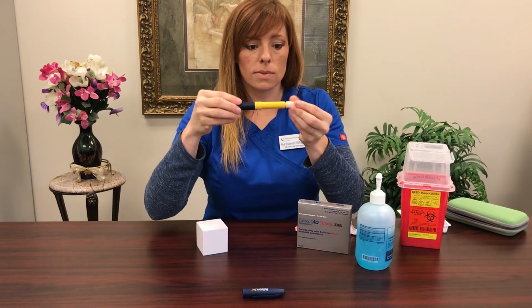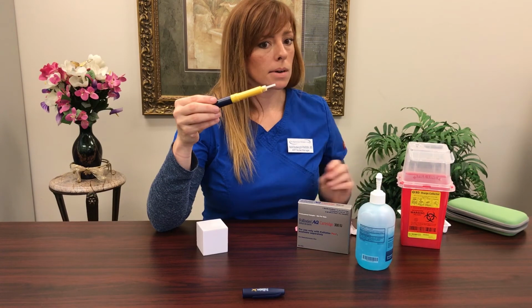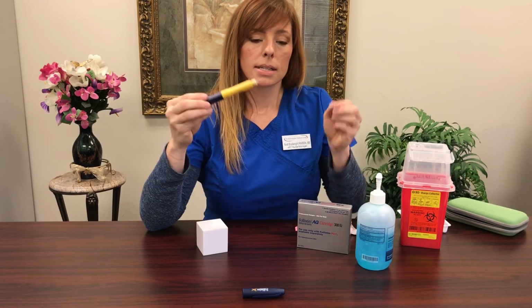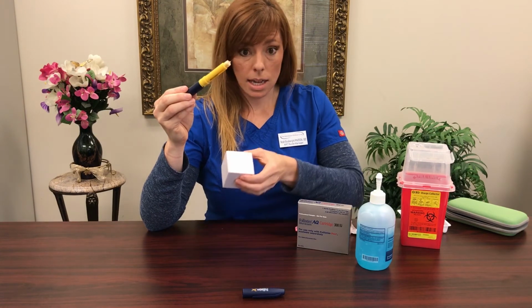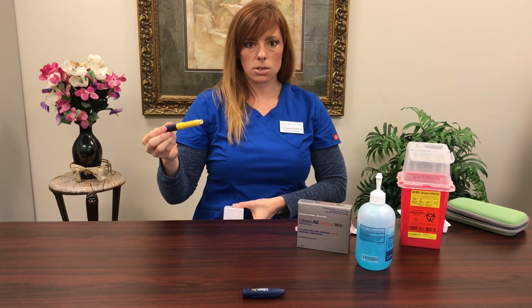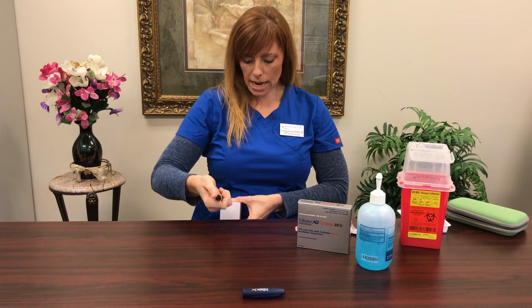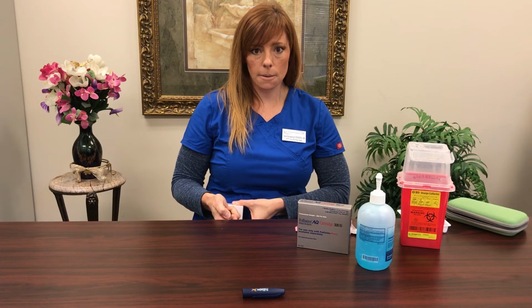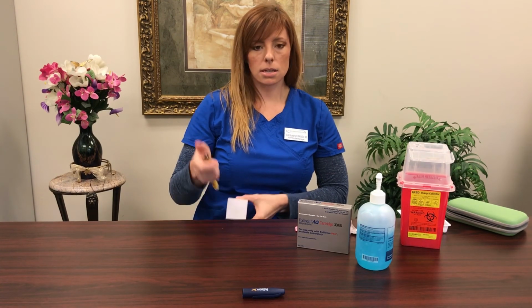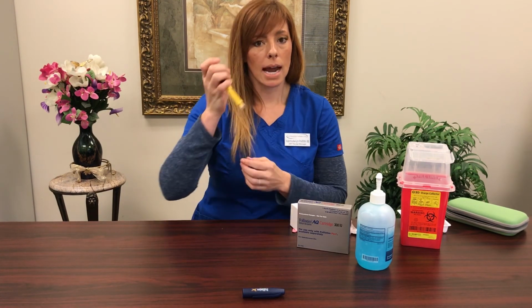All we have to do is remove the safety cap. There's actually 2 of them. They want us to be extra safe. Take this second safety cap off. No priming needed. Our skin is clean. We're going to pinch the skin towards our belly, go straight in, and with our thumb we're going to press and click through till we see the 0 in our window again. So clicking all the way down, we're going to see the yellow part of the pen come flush with the window. Pull that out when you see the 0 right here, and then you're done.